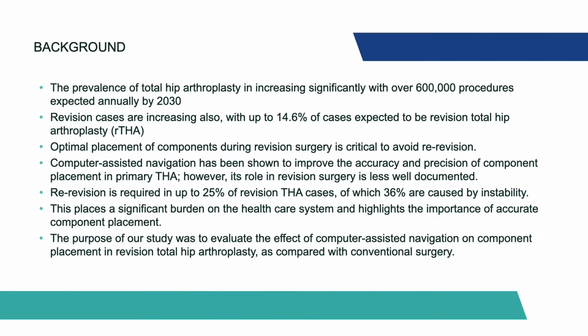The purpose of this study was to evaluate the effect of computer-assisted navigation on component placement in revision total hip arthroplasties compared with conventional revision total hip arthroplasty.